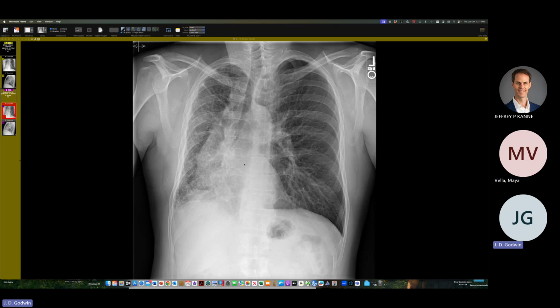And so here's that previous case, and this case is very similar to the case that I showed 3 weeks ago. For one thing, there's a reticulation down here, which turns out to be caused by vessels penetrating the lung and supplying some blood flow to this right lung, which is otherwise deprived. So there was, as in the previous case, this rightward mediastinal shift. The right lung is small.